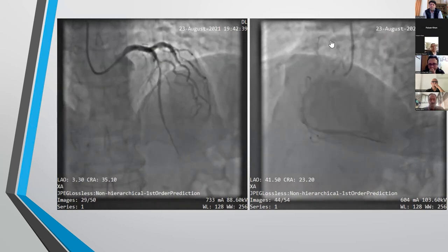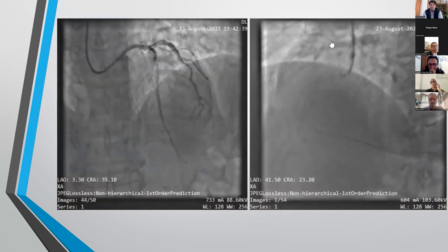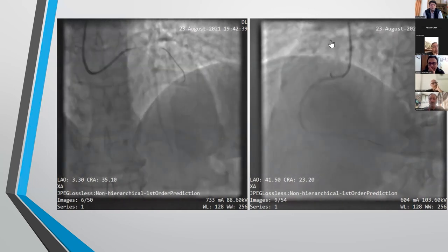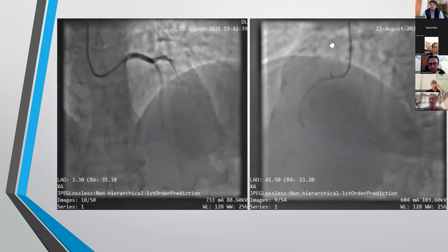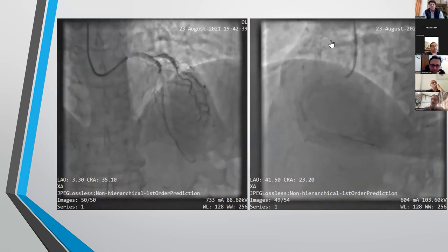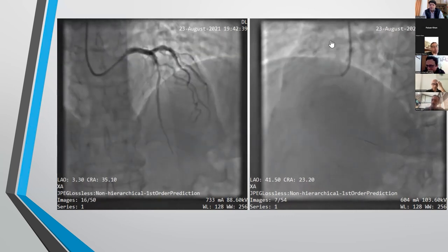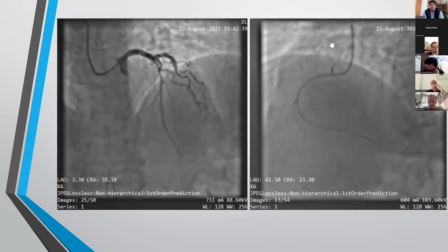हाँ, वो पिछली टॉक में सारी चीजें बड़ी डिस्कस की थी, but that's a very valid point, the pitfalls, especially for IVUS में जो इमेज आप कहते हो फ्लोट करते हो नजर आ रहा होता है, but iFR में रिकॉर्डिंग्स are very crucial, very important point. And common pitfalls are: एक तो आपकी अगर वायर कहीं छोटी ब्रांच में वेज्ड है तो उससे आपकी आर्टिफैक्ट काफी आता है, तो उसमें आप एडजस्ट कर सकते हैं.